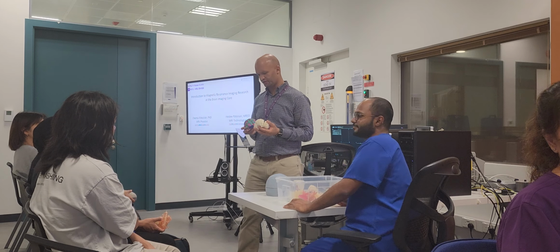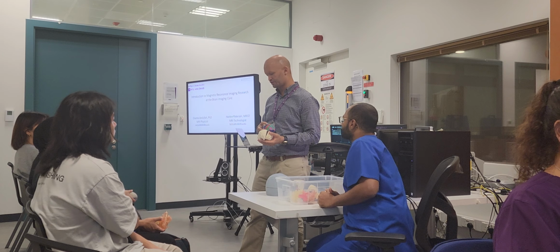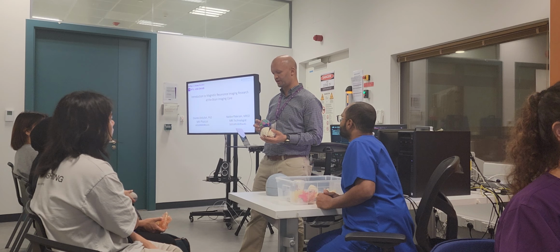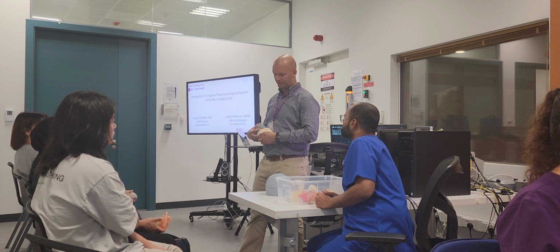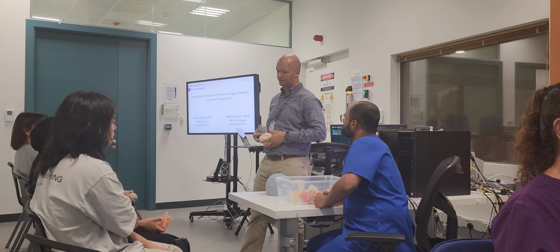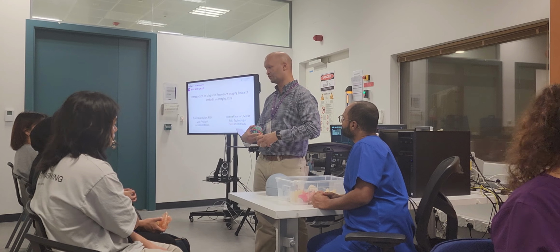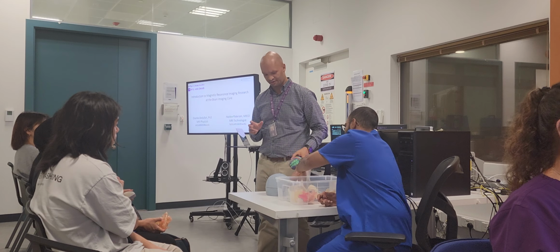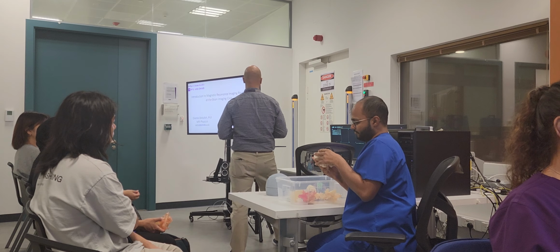We'll talk about this. On the top is the cortical layer. For example, this blue thing is the motor cortex. Underneath it, the cable that takes the instructions from the motor cortex to my hands is carried through the axons, the white matter. So I'm digitally removing the cortical layer so you can expose the highways underneath it. At least that's my hope. I don't have significant brain atrophy.